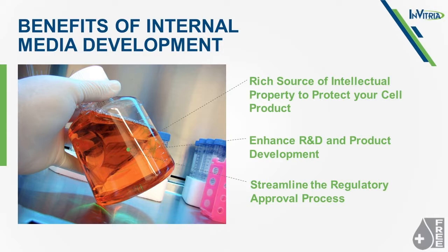There is a potential pitfall in that if you reduce FBS too far, the supplement cannot rescue the reduced FBS culture. This would indicate that there are other proteins or components present within serum that have been effectively reduced to levels that are below what would be required for that cell type, and that replacing only albumin, transferrin, and insulin is not adequate to rescue that concentration of serum.